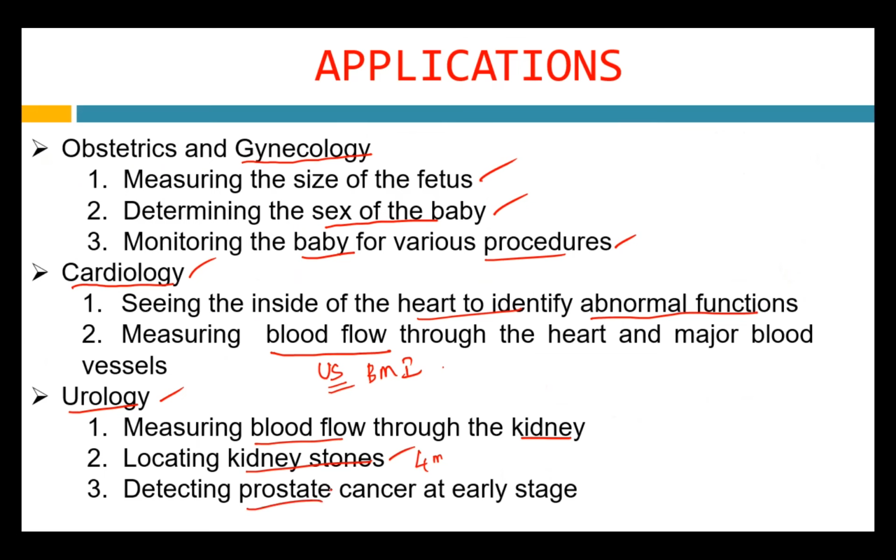And you can detect cancer, like prostate cancer, or cancer in the kidney or liver, at a very early stage using ultrasound. So these are the few applications. This theory part of ultrasound is over.